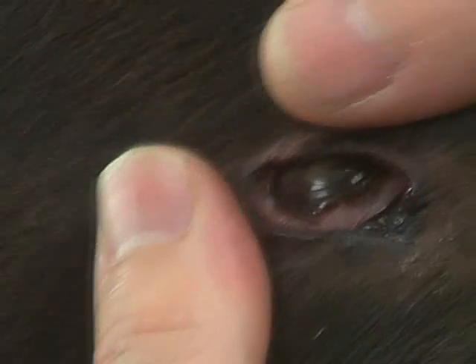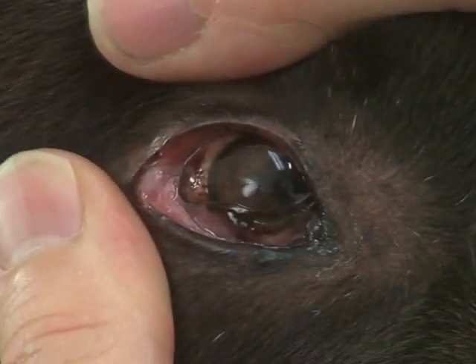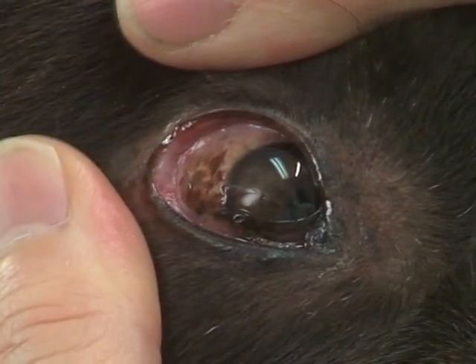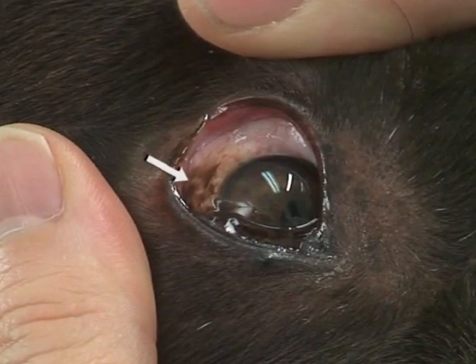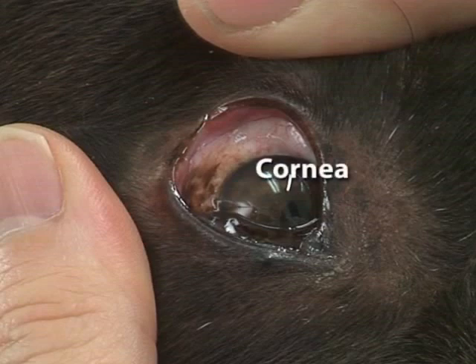The normal conjunctiva exhibits regional variation in colour, which needs to be distinguished from inflammation. There may also be normal pigmentation. The underlying sclera is usually white. The appearance of the cornea should also be noted at this stage, though more detailed examination is performed later using a light source.